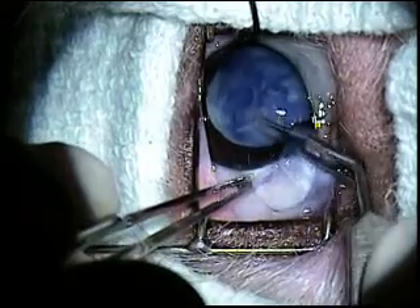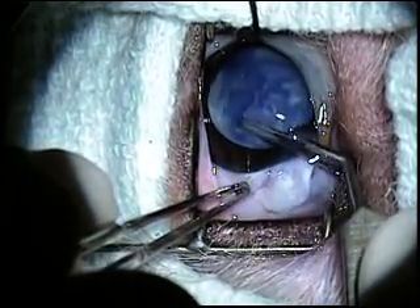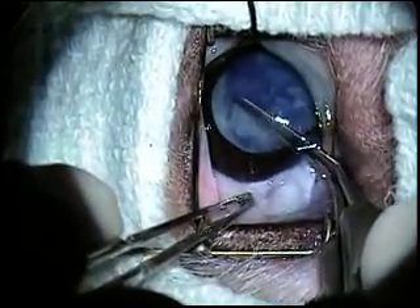Once the patient has been induced under anesthesia, the eye is prepped for aseptic surgery and the globe is positioned under the operating microscope.